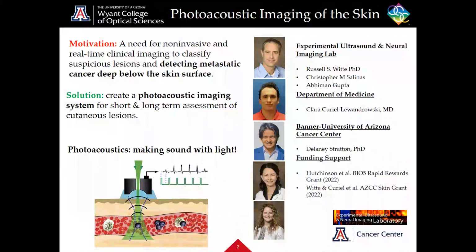So the motivation for our research was that there's an unmet need for a non-invasive and real-time imaging method to detect metastatic cancer deep below the skin surface. Traditional optical imaging systems such as confocal microscopy really are unable to have a depth penetration beyond a millimeter into tissue. And so this is something where it would be particularly advantageous to have that depth information of these lesions.